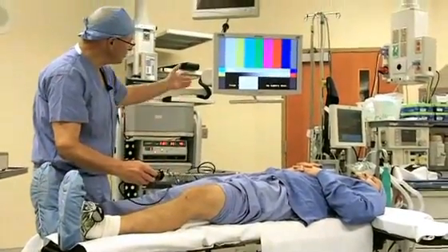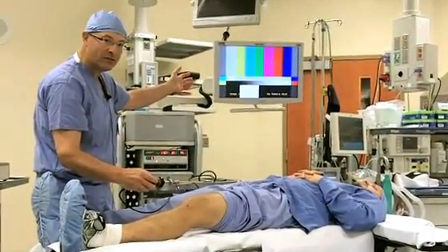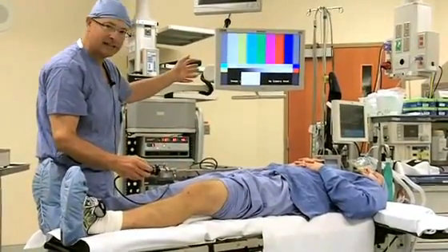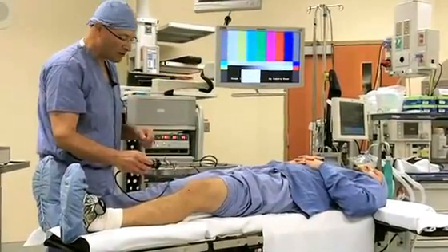And we visualize the surgery through a TV monitor that you see over here. The work is all done down at the knee level. The visualization is all done on the TV screen.